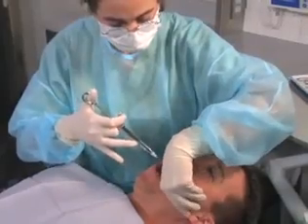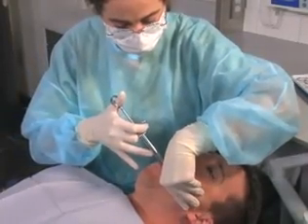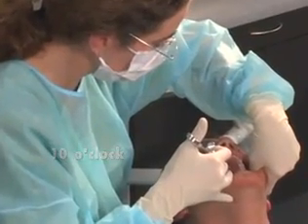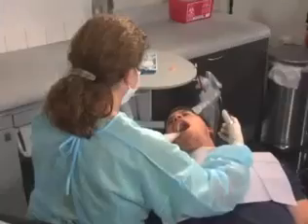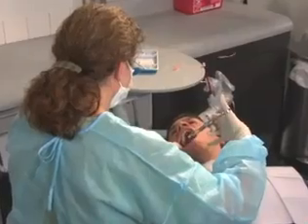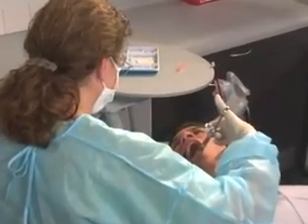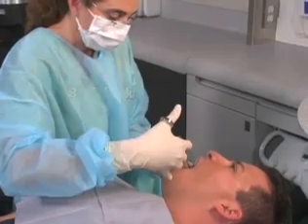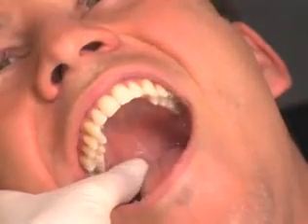For the left Gow-Gates mandibular nerve block, the right-handed operator should sit in a 10 o'clock position, facing in the same direction as the patient. For a right Gow-Gates mandibular nerve block, the right-handed operator should sit in the 8 o'clock position, facing the patient. The coronoid notch is palpated.